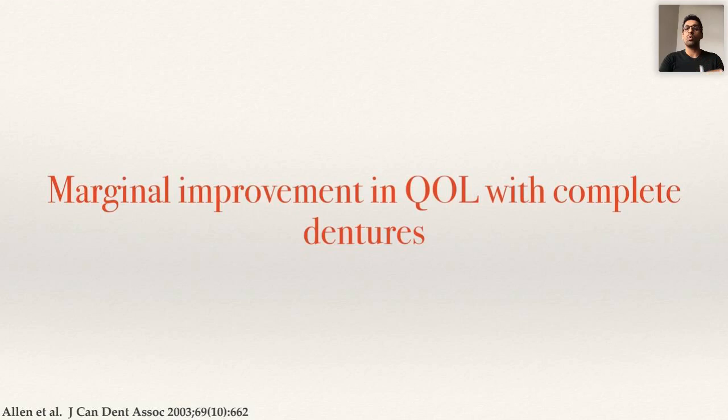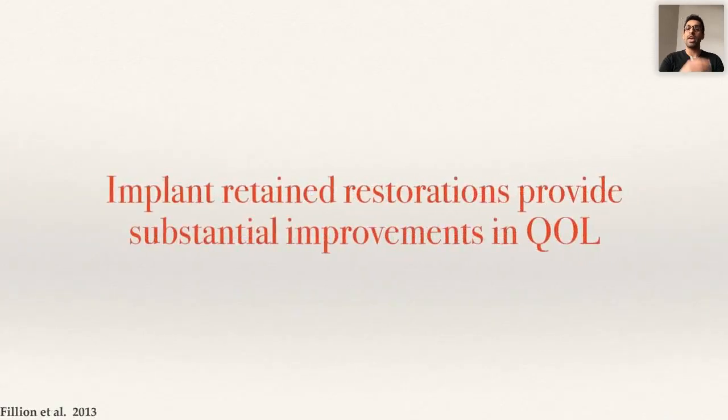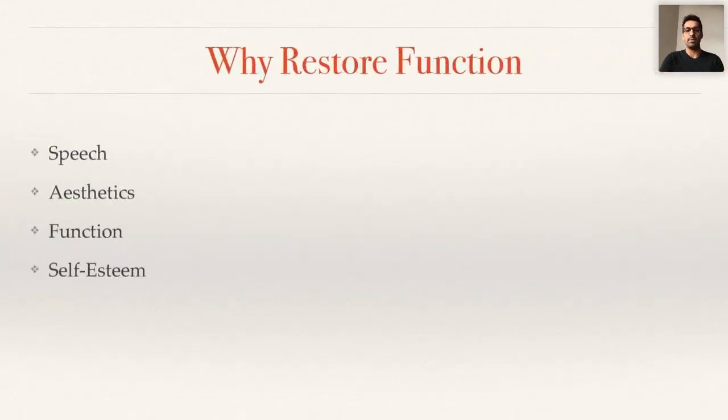We know that there's only a marginal improvement in the quality of life for patients with complete dentures. And we know if we're able to deliver patients an implant-retained restoration, then we can improve the quality of life substantially.